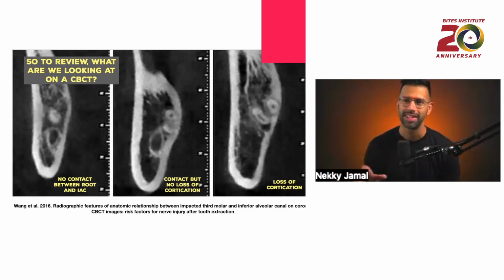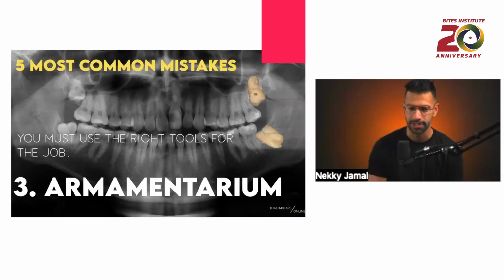Just because you have a CBCT does not mean you will avoid the third molar nerve injury. Okay. I don't want you to get in trouble. I just want you to use all these tools for proper informed consent and when you're talking to your patients.